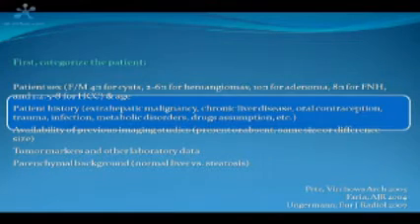So let's characterize these lesions. First of all, we have to categorize the patients. A number of lesions have a difference in the sex distribution and the age, of course, at least between childhood and adulthood. And of course we will consider the history of the patient: cancer patient, chronic liver disease, or other things in the history, and we will try to check the previous studies.